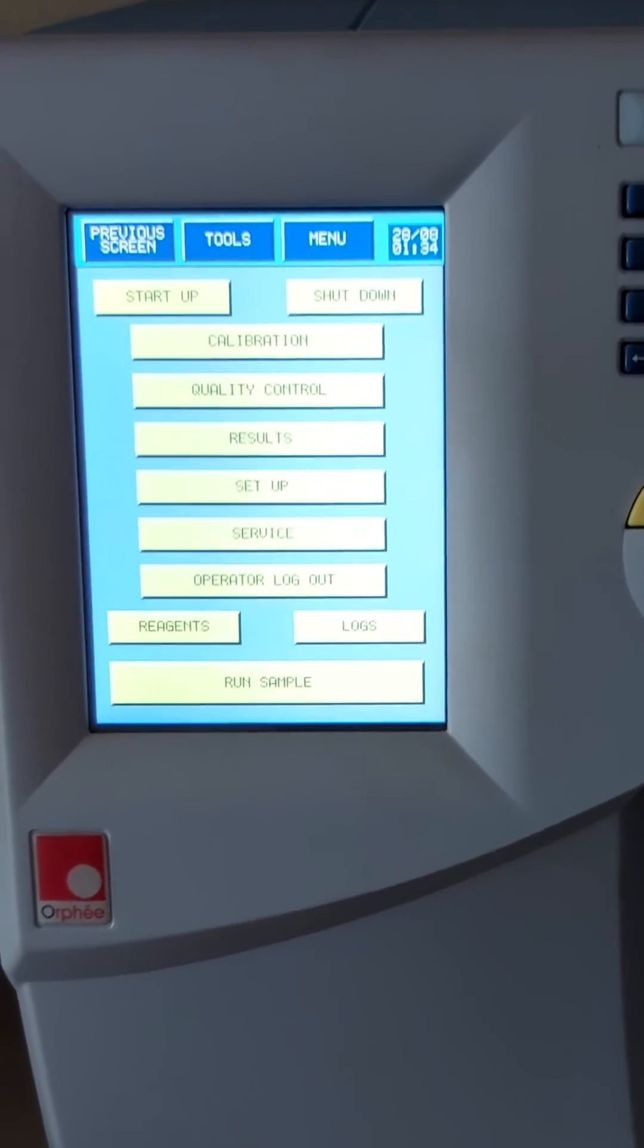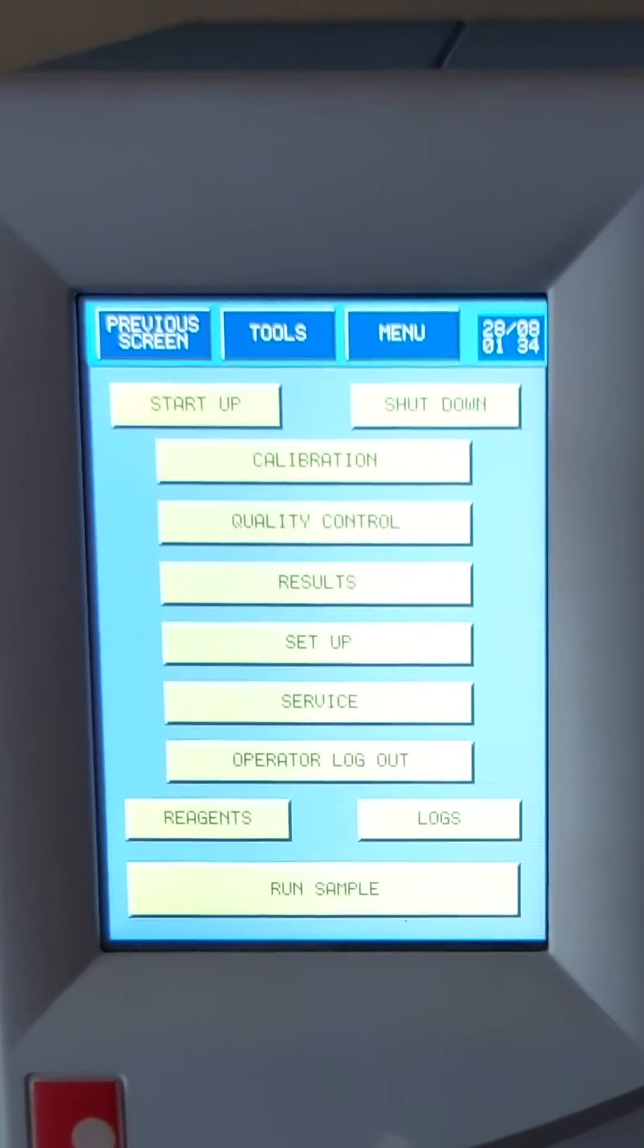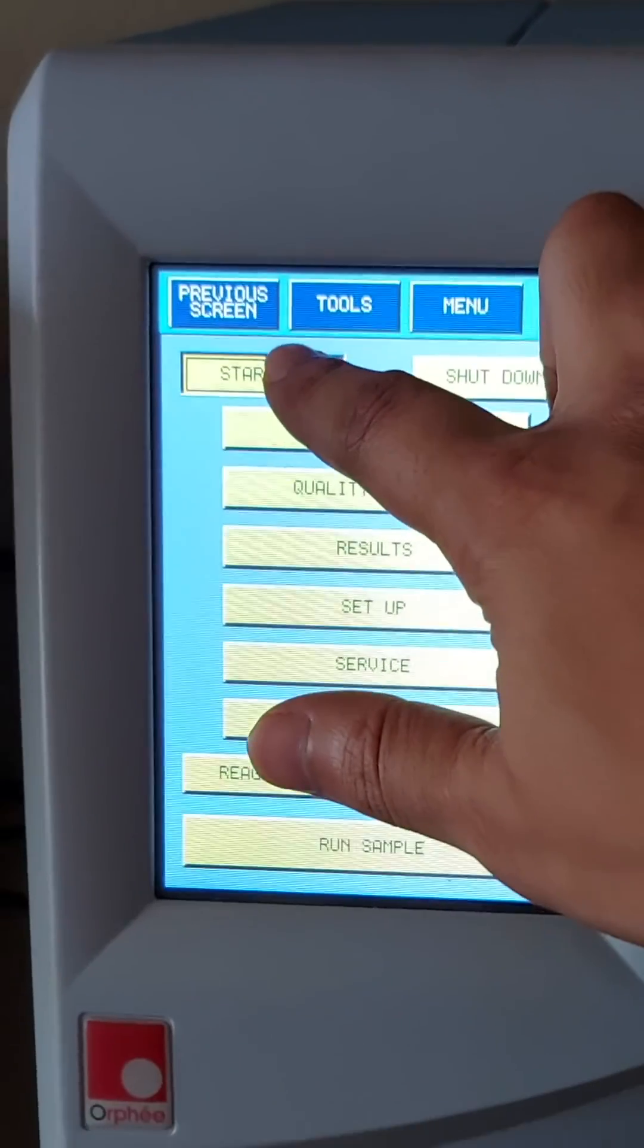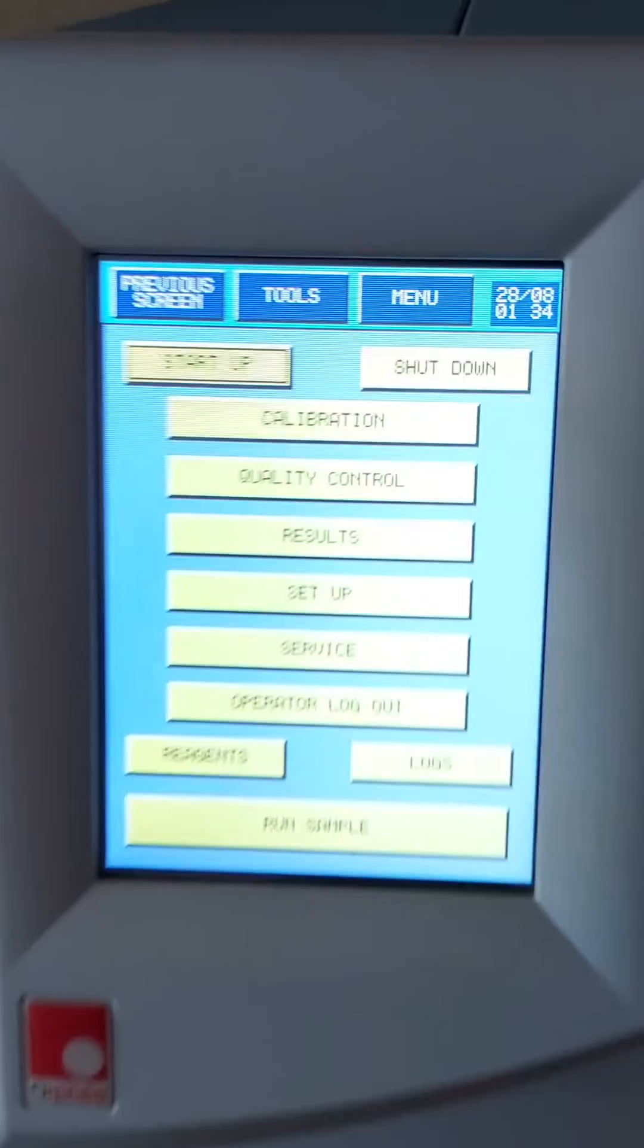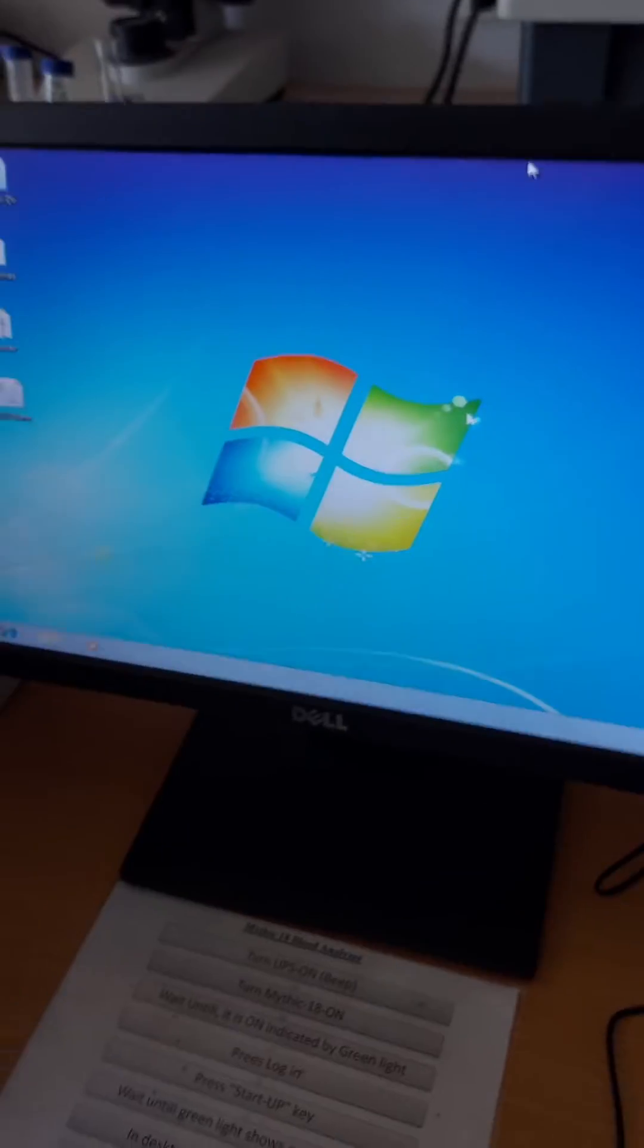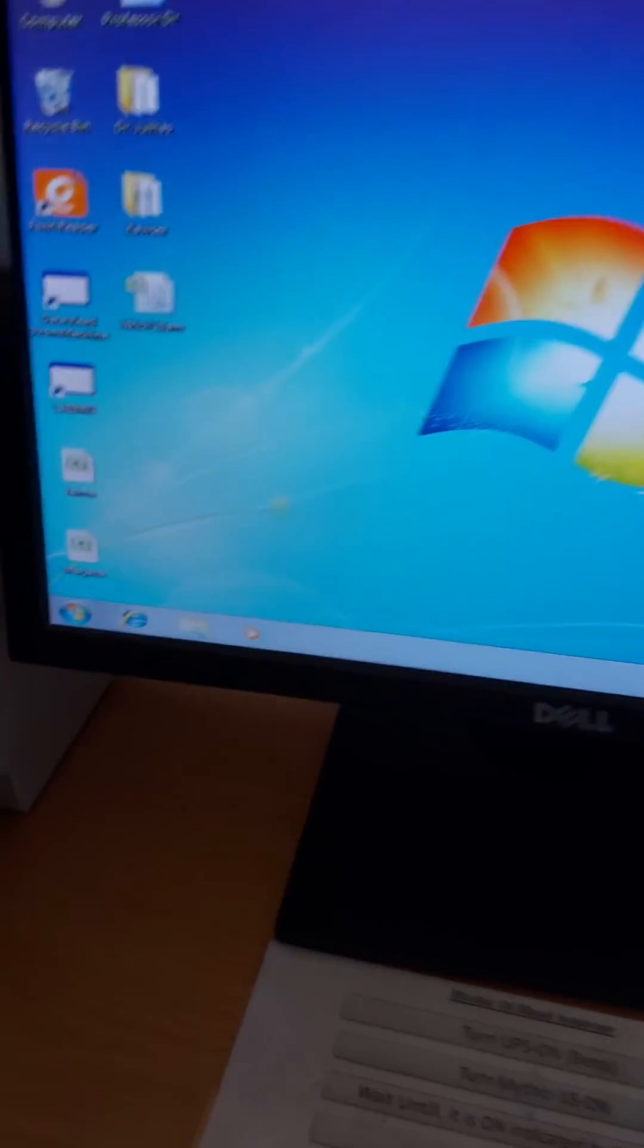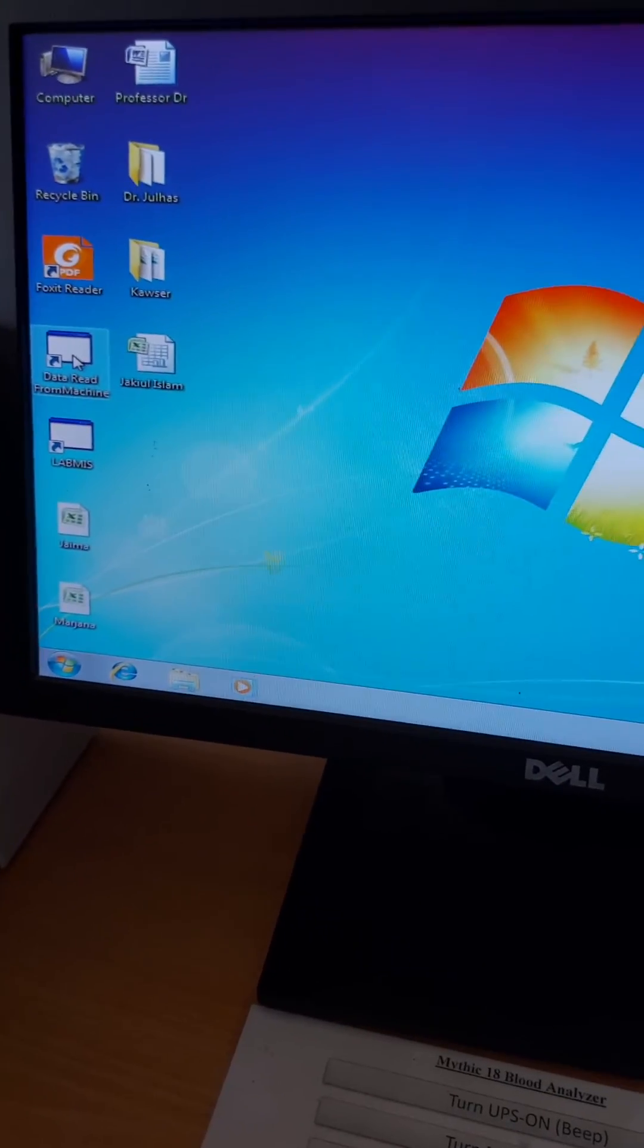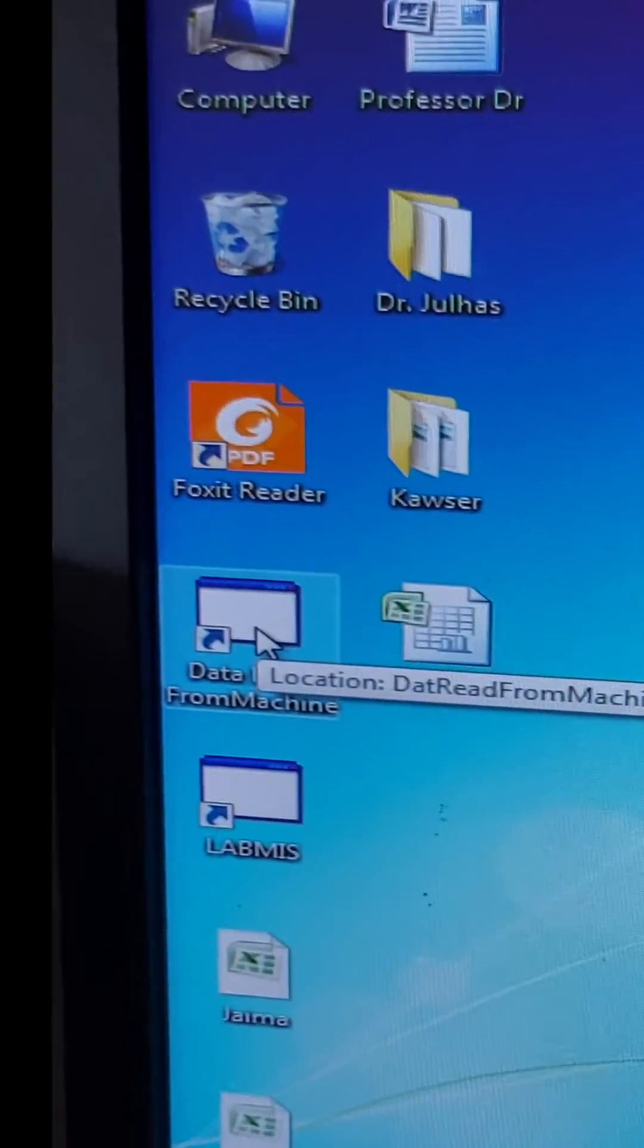After turning on the blood analyzer, we will hit the startup button on the display. Then on the desktop monitor, we will open the data reader installed.